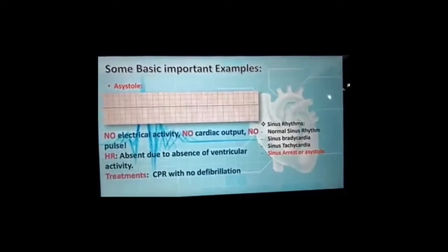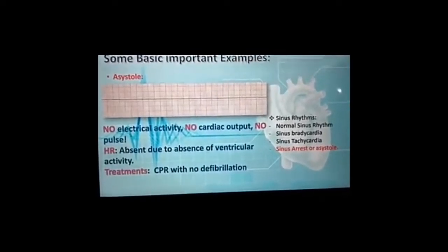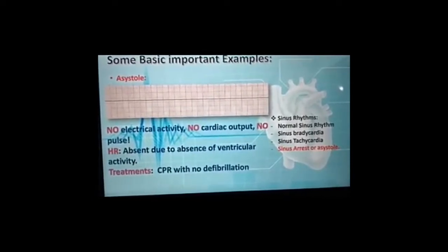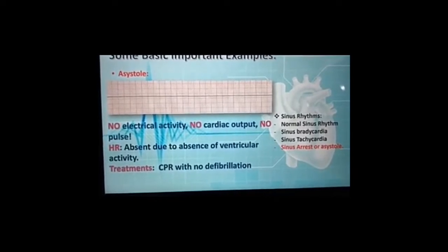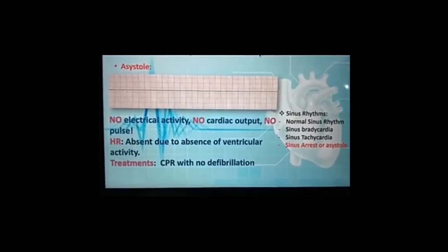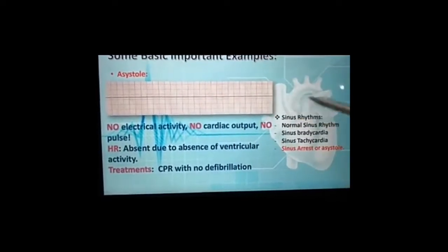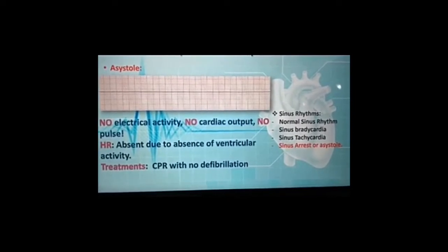Okay, the last thing in this group is asystole or sinus arrest. As you see, there is no electrical activity, so no cardiac output and no pulse. If you want to know the heart rate here, it is absent due to absence of ventricle activity. There is no ventricle activity. The treatment here is CPR with no defibrillation or shock.